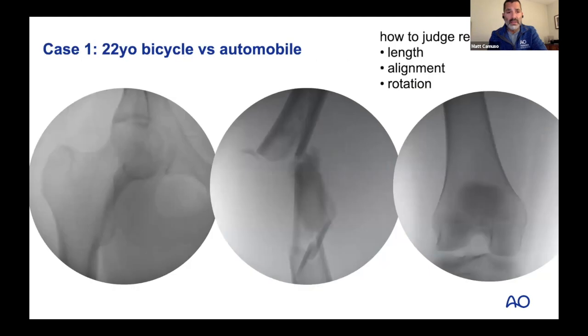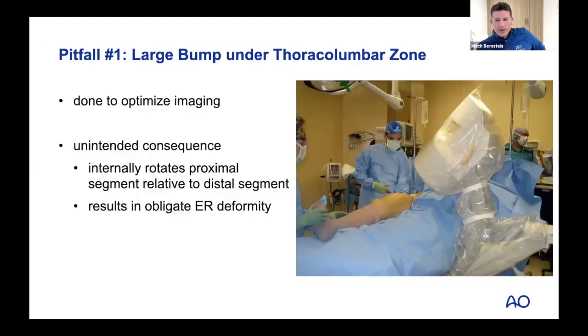Just a comment, Matt, because I've had that issue a lot where, inadvertently, you're trying to get the perfect lateral distally, so you're externally rotating and causing that deformity.